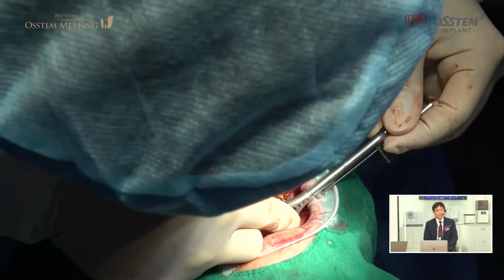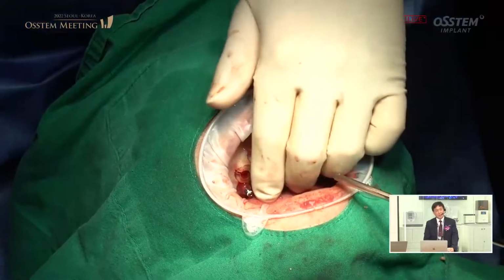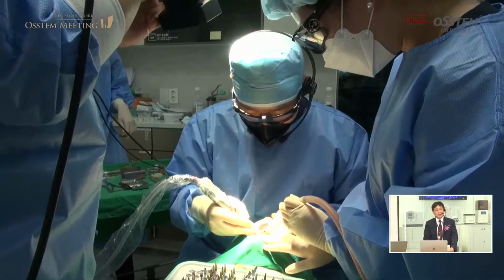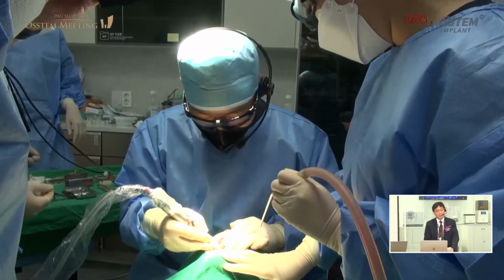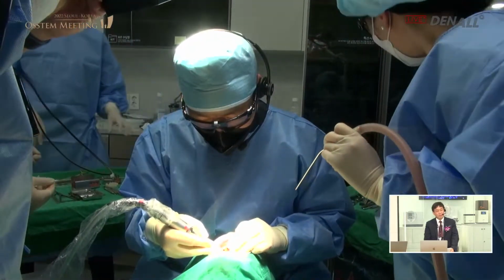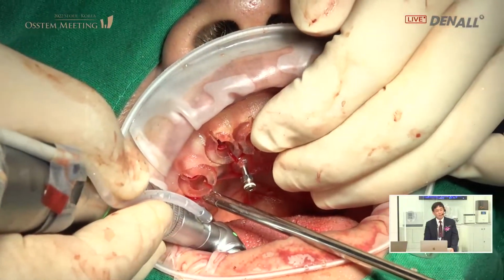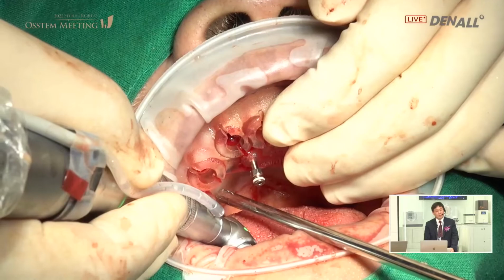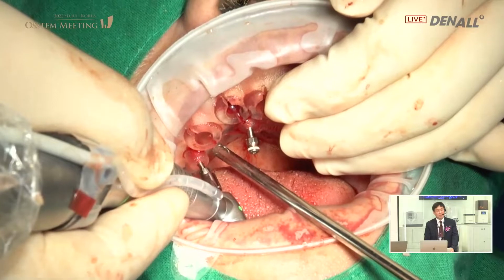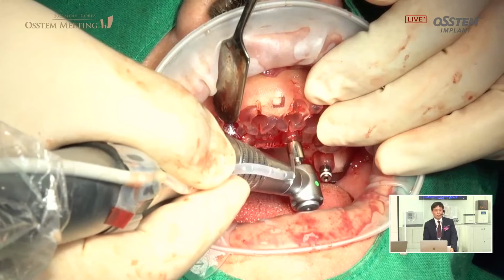In number 15, it's barely 30, and in the rest of the area, as planned, immediate loading is going to be done, but when doing an occlusal adjustment, I'm going to make it so that strong occlusal force is not applied to number 15. I'm going to ask the patient to eat softer food for the next couple of months to overcome the situation.